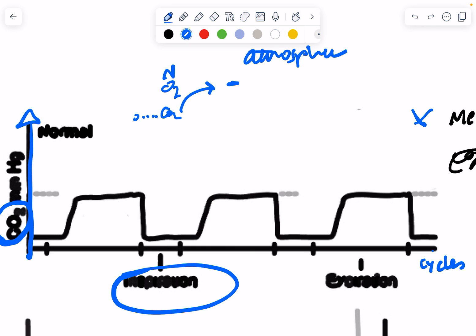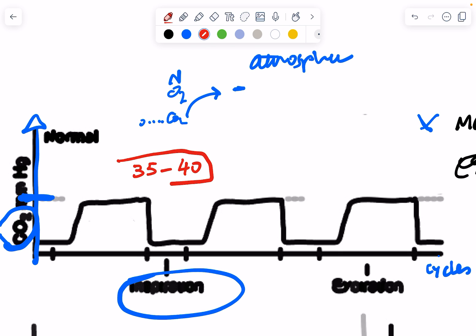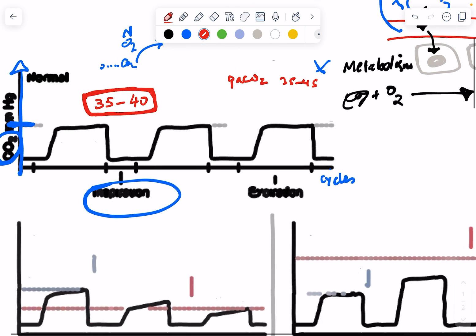The higher this wave, the more the CO2 you've exhaled, the lower, the lower. And there is a level here, a normal range, which is around 35 to 40 millimeters of mercury. That's very close to the PaCO2 required in the arteries, 35 to 45. But this is an upper limit of 40. Let's take a look at what can happen with different abnormalities.